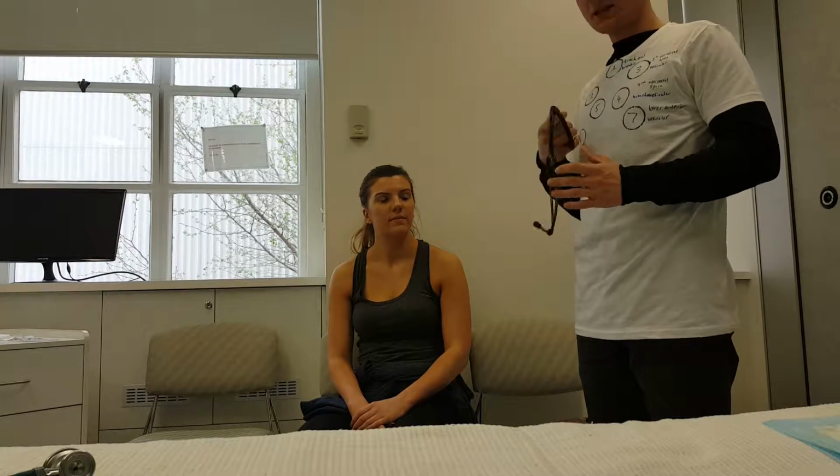Today we're teaching how to auscultate breath sounds with a stethoscope. My name's Jesse, this is Lisa, she'll be learning today.